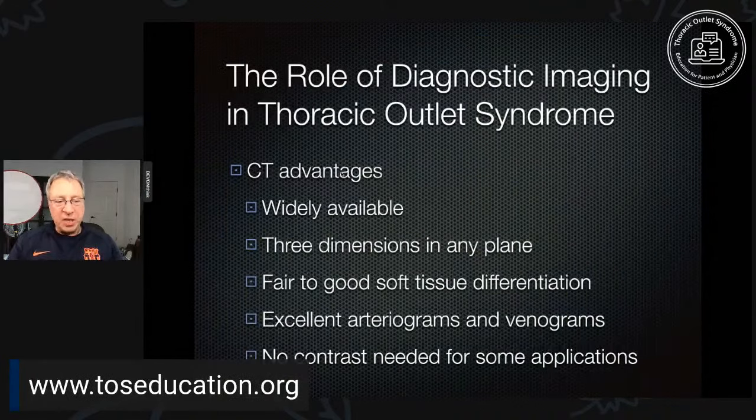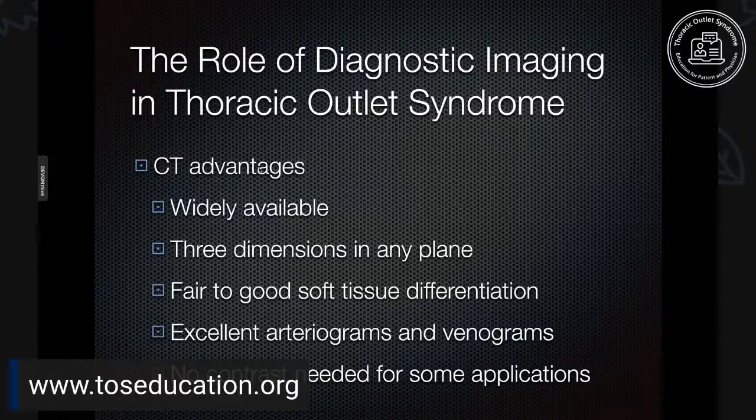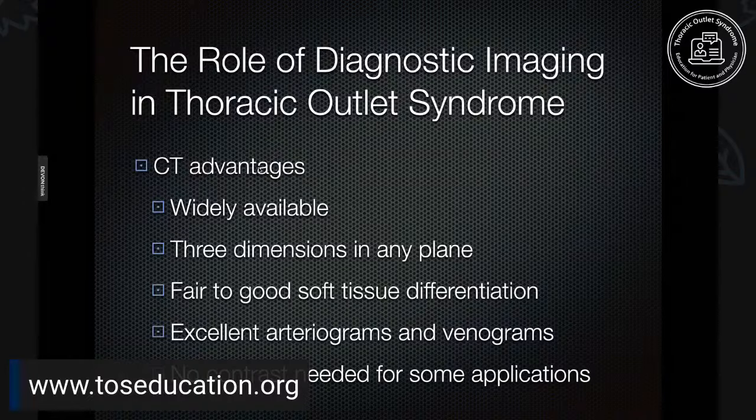So the advantages of CT are it's widely available. It's available in most hospitals and emergency rooms. You can see all 3 dimensions in any plane that you pick. Once you acquire the images, you do what we did on some of these earlier images and you stack them together in different directions and you manipulate that data to create very nice pictures.